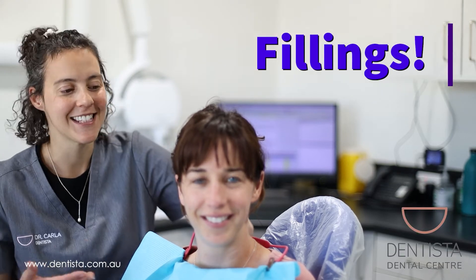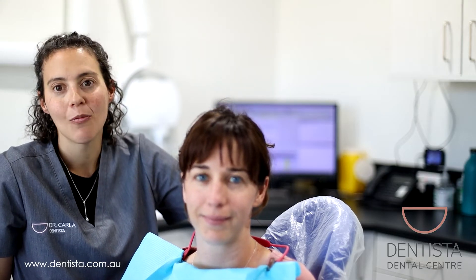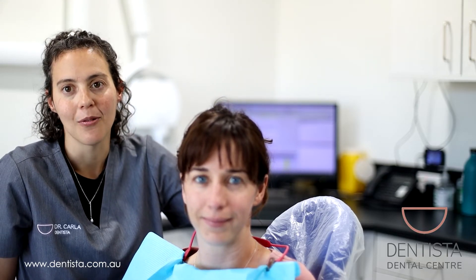Hi everyone, this is Dr. Carla and this is our lovely patient Erin. We are just about to do a filling for her. So we're going to walk you through the process of how we do it. We're going to numb Erin up and then we're going to show you why her tooth needs to be filled.